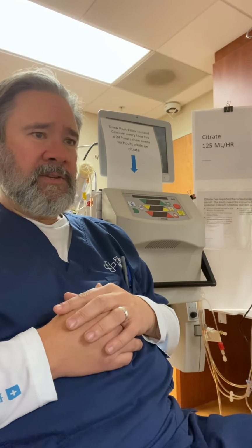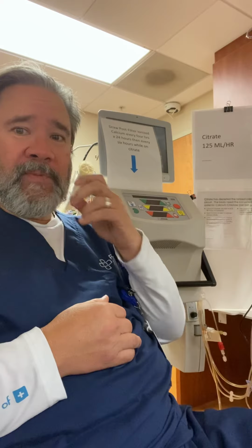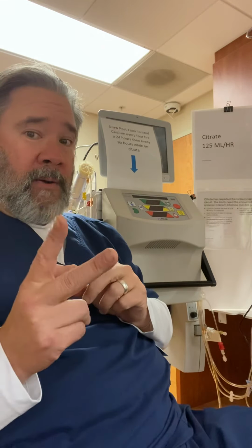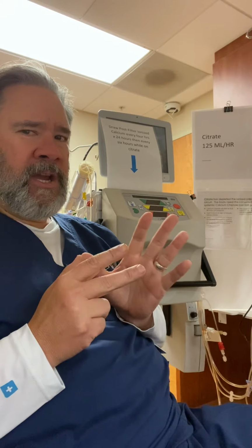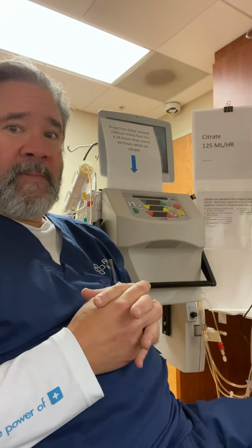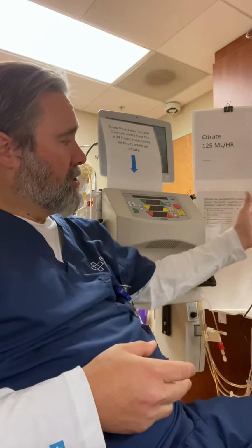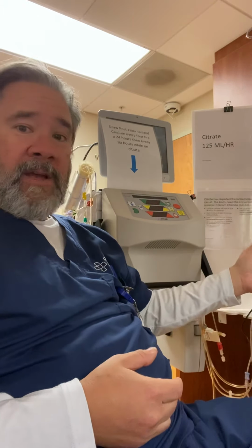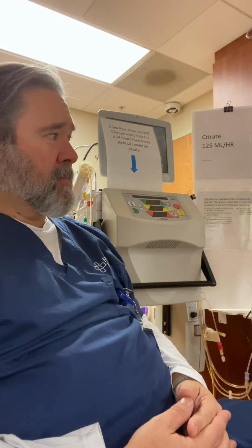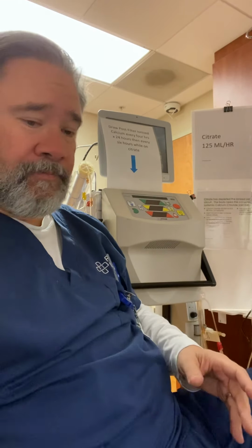Okay, so those labs, like all of our labs, are going to be 4 to 6 hours, and 2 hours after you make a change. So if you make a change, your 6 hours now goes to 2 hours, because we want to make sure that we've made a proper adjustment. So the calcium chloride is going at 55 to 88 milliliters an hour for 15 minutes. Then we need to start looking at our citrate.